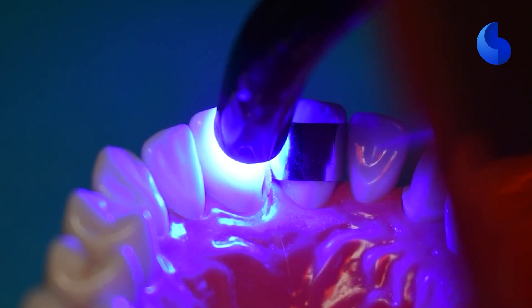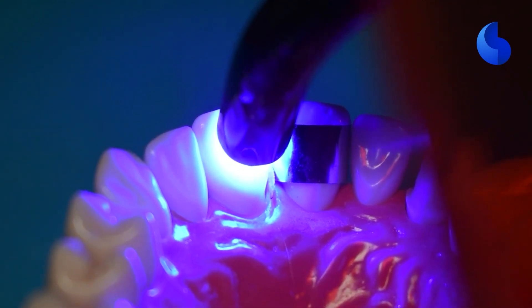The first thing we did is we applied some bonding agent, thinned it out with some air water spray, and we are now curing it to get ready to add some composite into this cavity.